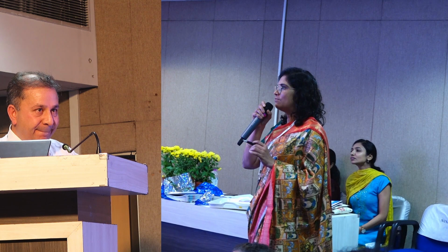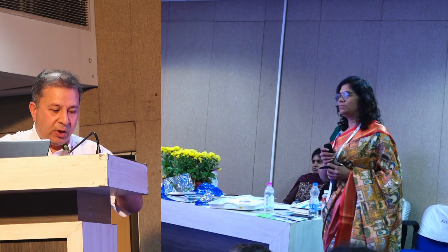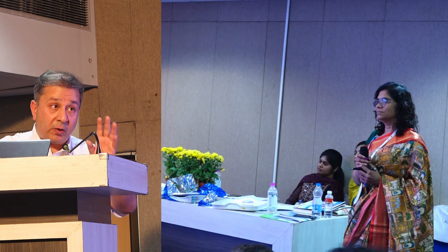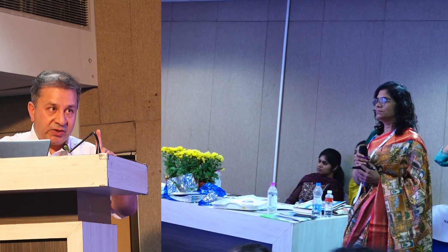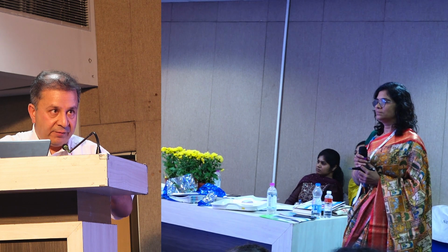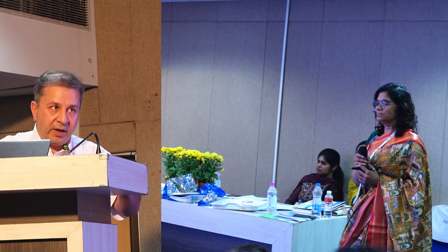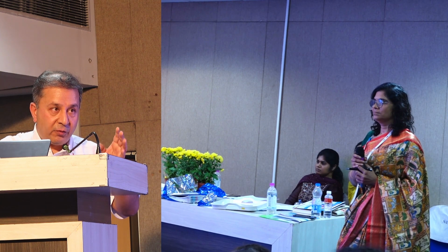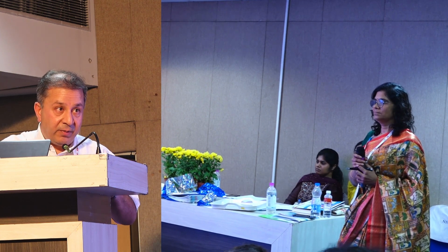So my concern was, in what situations do you recommend this solid phase assay on the flow platform, and how sensitive and specific is it when compared to the Luminex? Okay, there is enough data today to suggest that if I do a Luminex-based assay, and I'm talking about a PRA here, not single antigen, and you've done PRA on flow, but you've done it correctly, please mind you, correctly, they are comparable 100%.